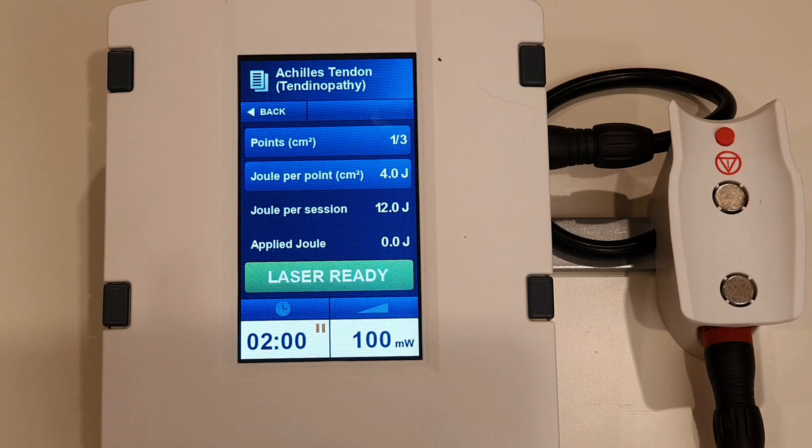Back at the laser now, we're going to start the treatment. You'll see the timer start to count down and the applied joules start to count up. You'll see this is spot one of three, so we're going to do a spot and then move the laser and do another spot.